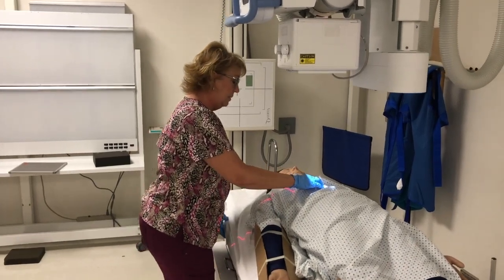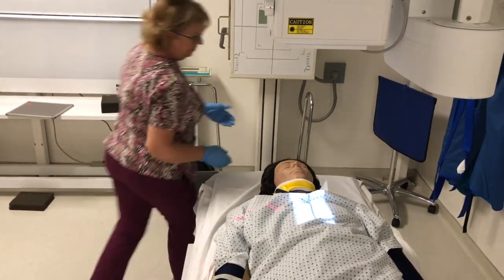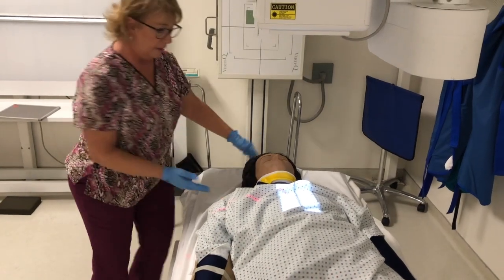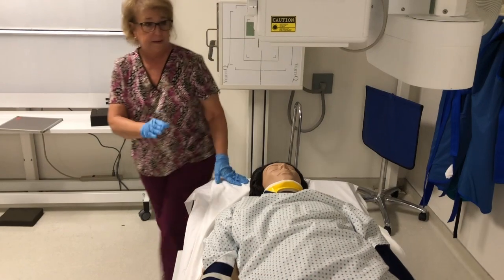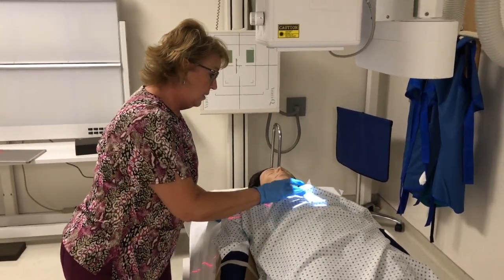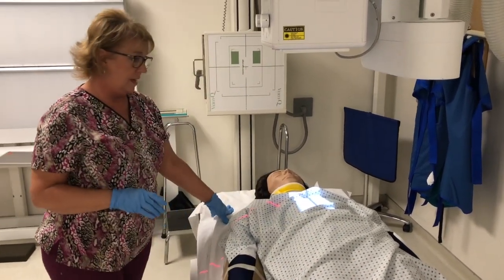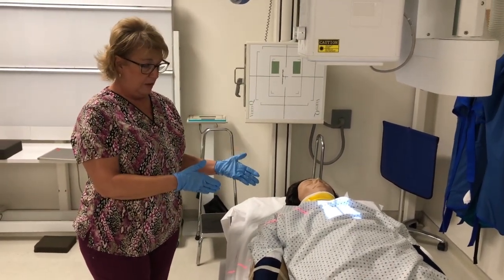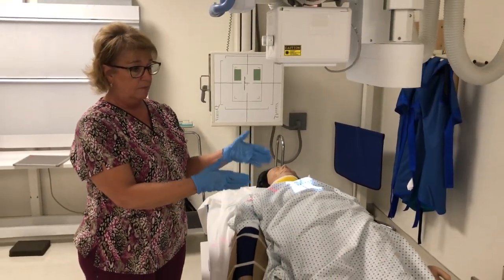Again, I would ask permission to palpate if the patient were awake. I would make sure that their mid-sagittal plane is as straight as I can get it. Center for thoracic spine, around T7. If they can hold their breath, I would have them. After I did the AP thoracic, I would move to the AP L spine and do the same thing.